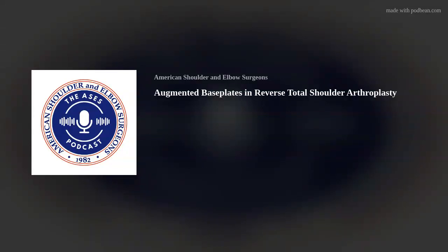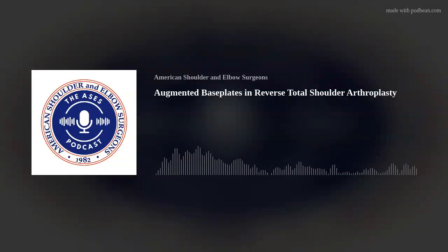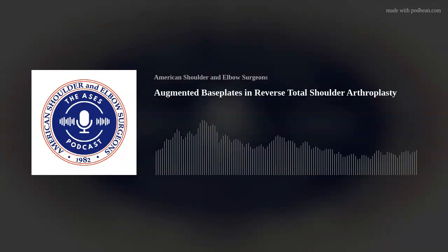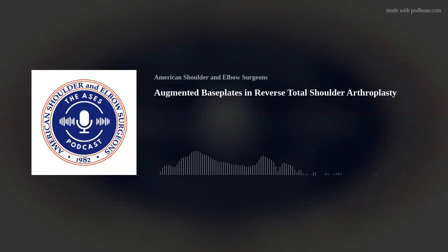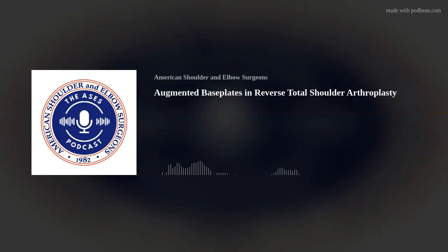One of my mentors professionally, Mark Frankle, has taught us a lot about the alternative center line, and I've used that, and I think it's a very good technique to be able to get good fixation. But I think not everyone is Mark Frankle. I've been able to replicate it, but it's sometimes challenging to get that perfect positioning. So that's my long-winded answer to that. I hope that helps a bit.